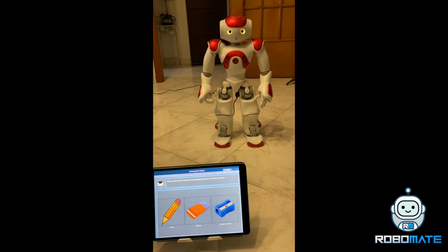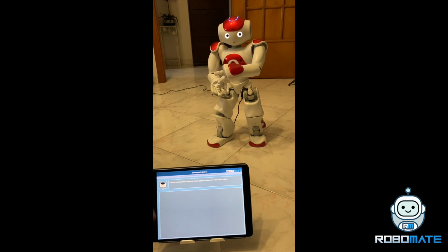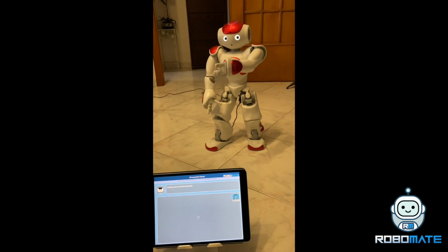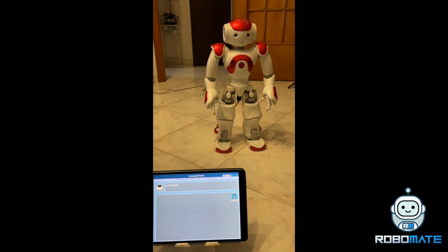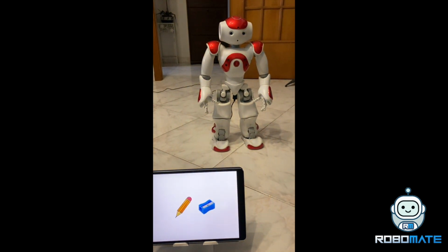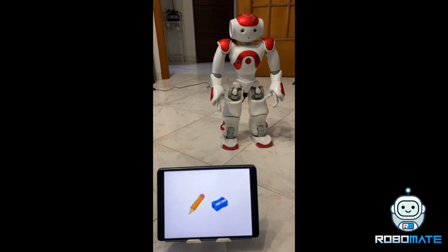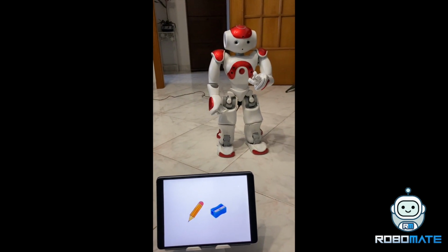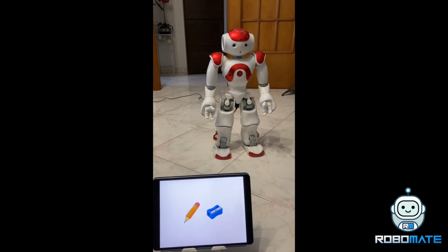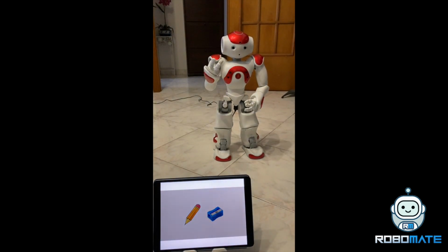And let's do a wrong response. Bene. Oh, sorry, it is right. Let's do one next. Ora stai attento. Now be careful. Adesso stai attento e dimmi quale oggetto mancava? Which one is the missing? Indicalo sul tablet.